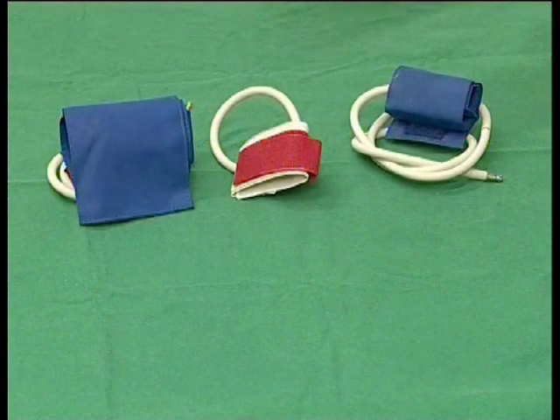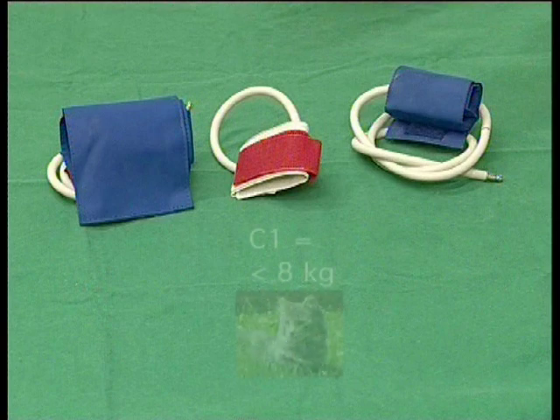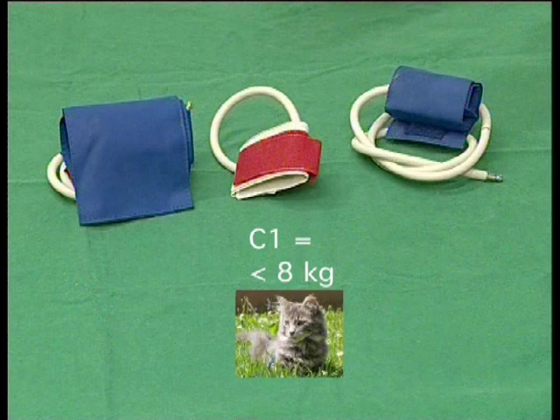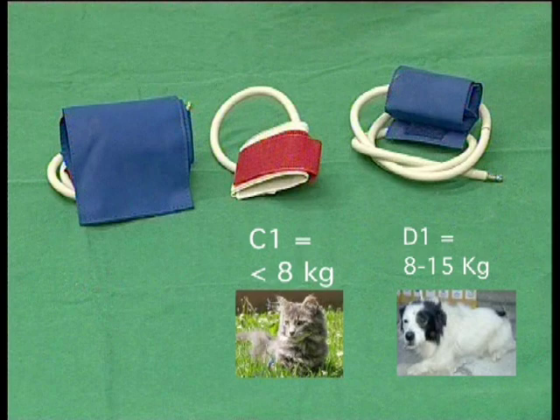Before measuring an animal, select the right cuff. HDO comes with three cuffs for small animal measurements. This is the cat cuff, which can be used for toy breed dogs, rabbits, ferrets, and other small mammals. This is the small dog cuff. This is the large dog cuff.